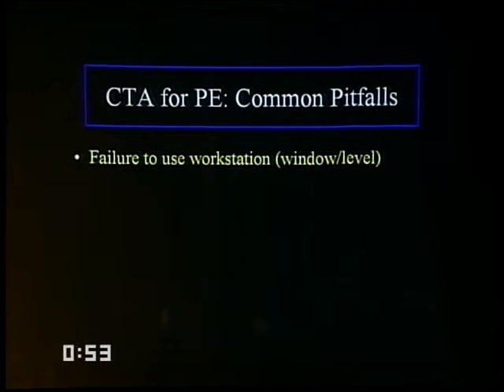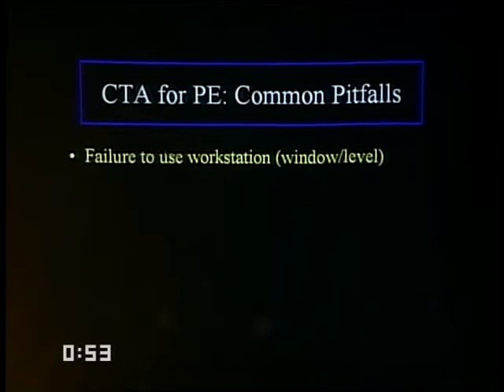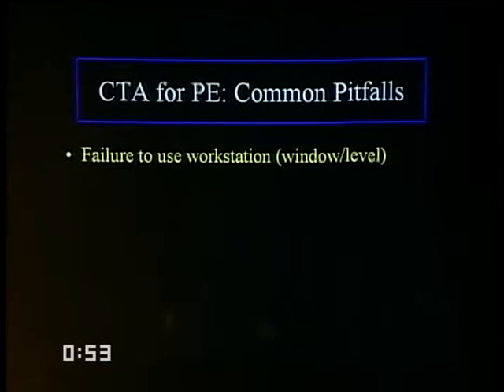Let's look at some of the pitfalls in diagnosing PE. One of them that's worth mentioning, even though many of you, I'm sure, are using soft copy now for diagnosis, is attempting to do PE studies using hard copy. And of course, if you don't have a PACS, you may not have any choice about this, but if you are in a hard copy situation, it's important to try to read the PE-CTs on even the CT workstation, on the QA workstation, rather than doing it entirely on a hard copy, because you really need to be able to window and level these individually depending on the degree of vascular opacification.